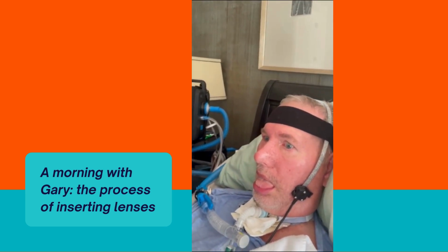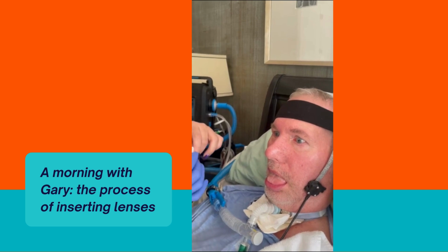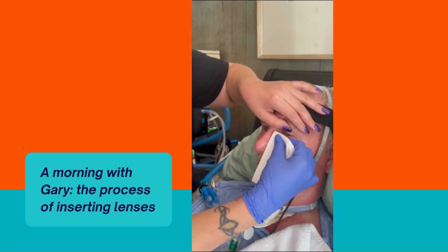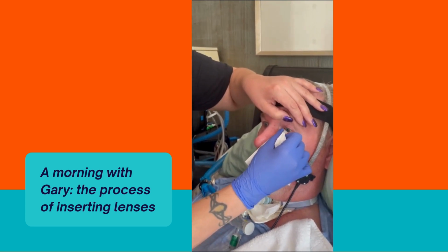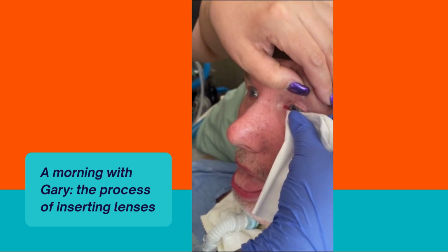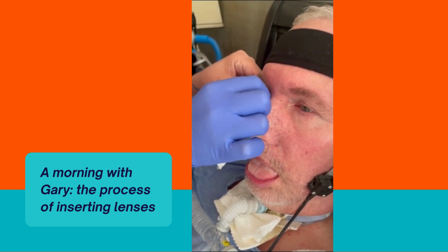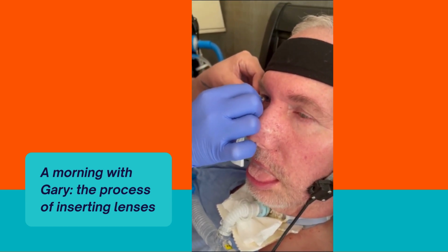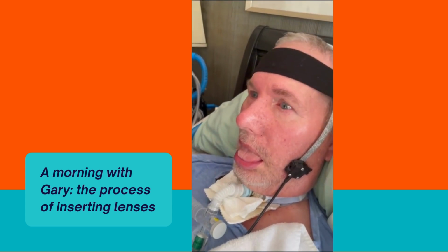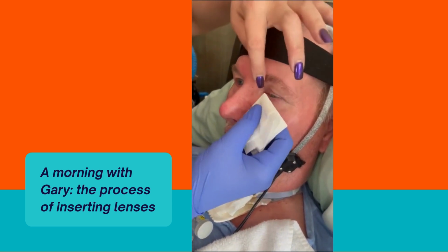So the last thing we need to do is get any lingering excess water or drops out of Gary's eye. I will take a squared up Kleenex, start at the corner, and press it into the crease, and we go straight across, because sometimes the excess drops will make it seem blurry, and that will pick up the drops. You don't have to do it directly in the eye, just in the crease and along the bottom. You're not looking to come in contact with the contact lens too much, because you don't want to move it. You want to keep as much of the eye drops as you can. So that's why we go directly to the corner.